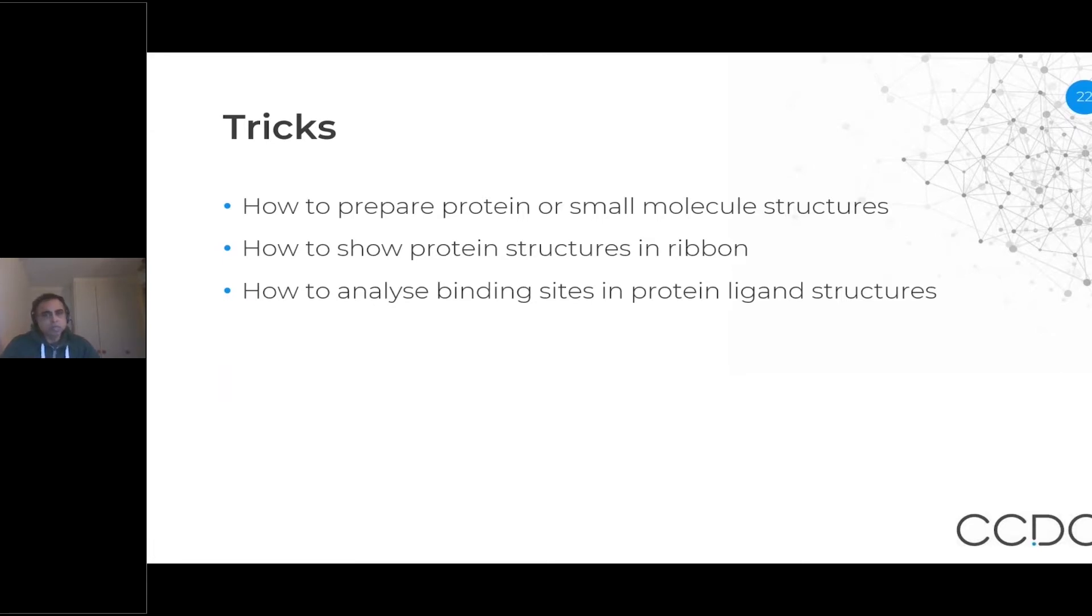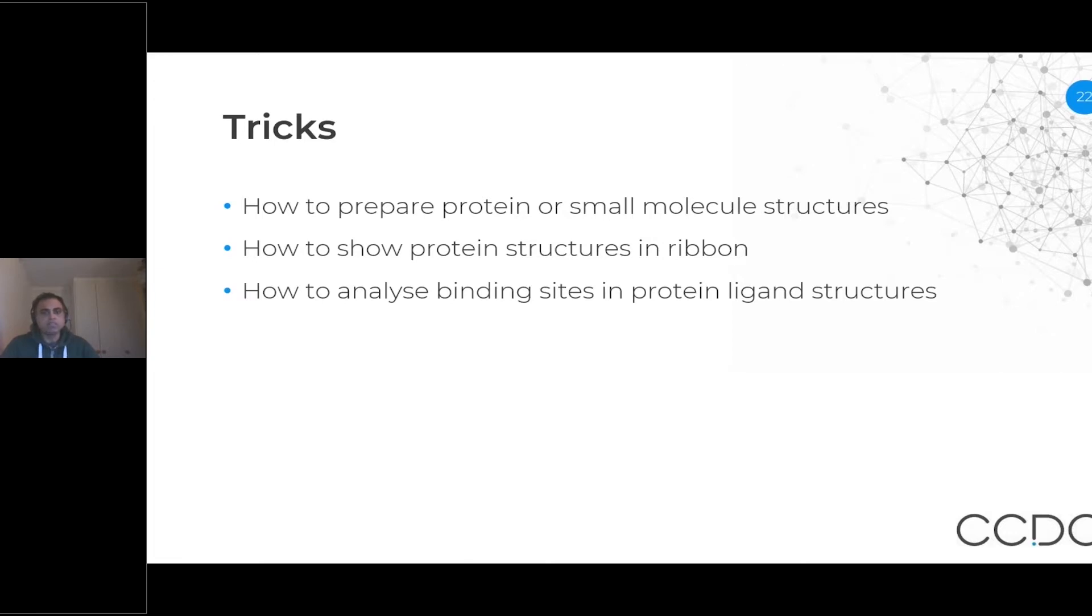The first one, how you can prepare protein or small molecule structures in HARME. I will also show you how you can display a protein structure in ribbon. And finally, I can show you a few tricks on how you can analyze the binding sites of a protein ligand structures.